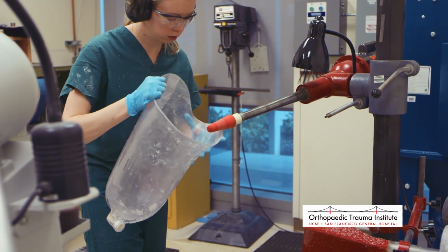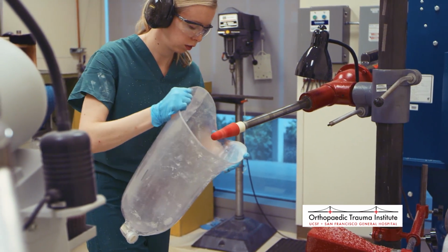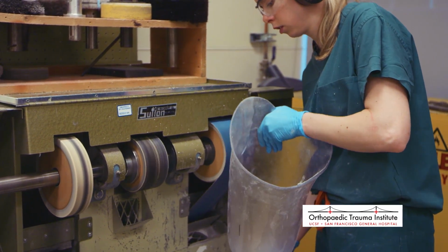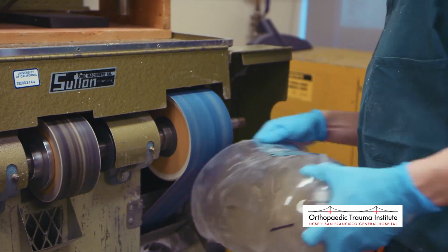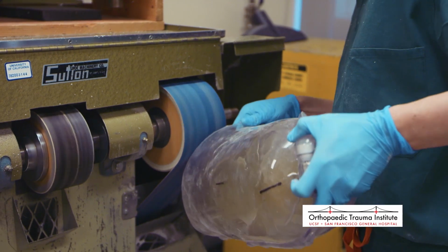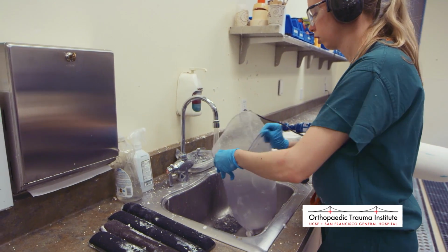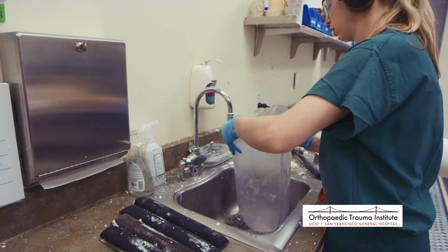It is important to note that there are a few ways to create a prosthetic test socket. The process Hannah uses now is the most common and illustrates the hands-on aspect of working in plaster as opposed to computer modification. These techniques vary with each individual and are constantly updating, so the experience can vary from patient to patient.